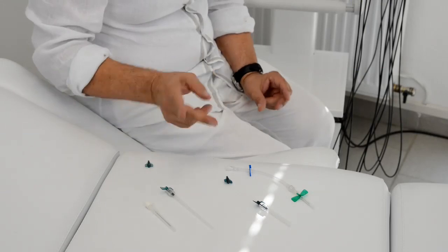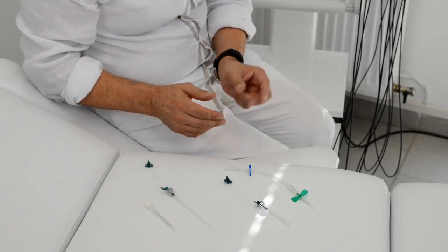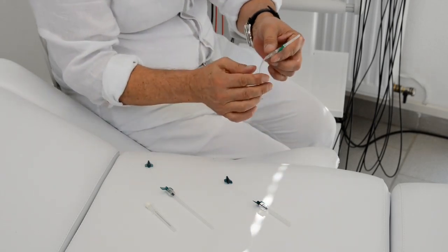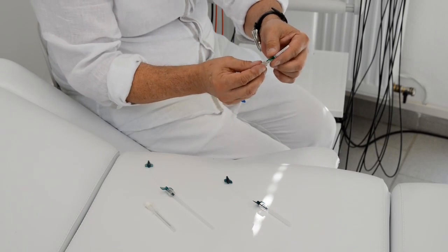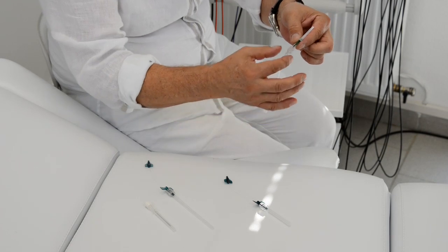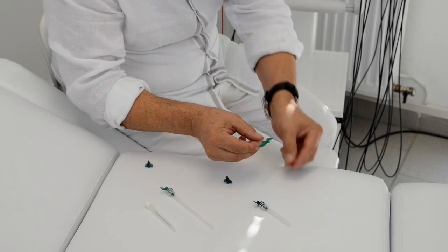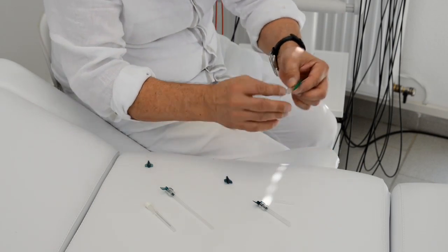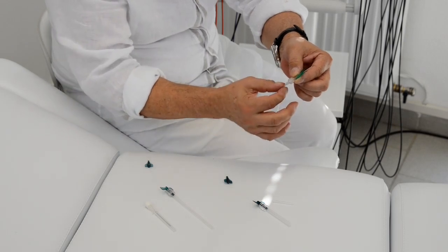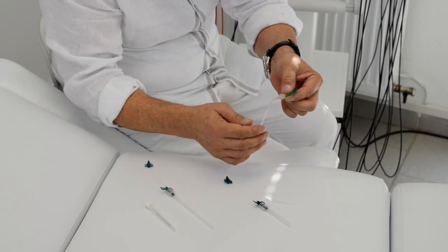Okay. So in the next step I will show you the different sterile products that we use for our treatments. For intravenous treatment we are using a 21G butterfly, which is connected to an extension tube. We use this one because working with this is more clean. So if we put the needle in the bloodstream, we can see the blood running back here and not running out of the needle. And we can make sure that we really put the needle in the right position.